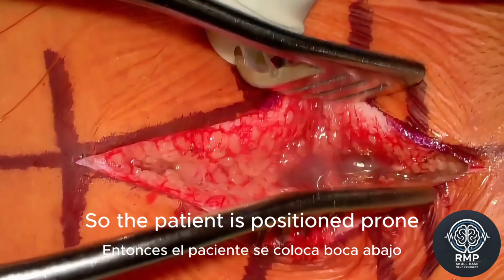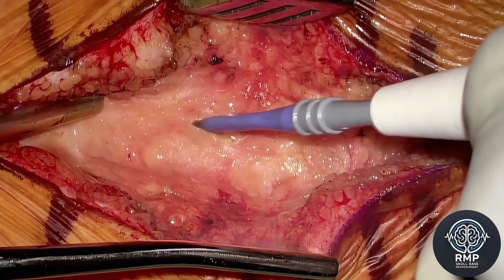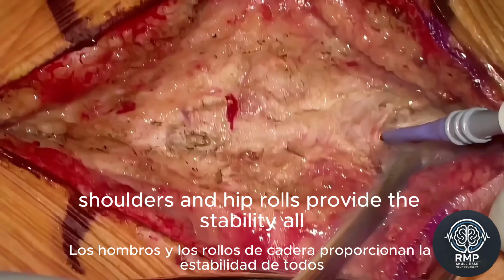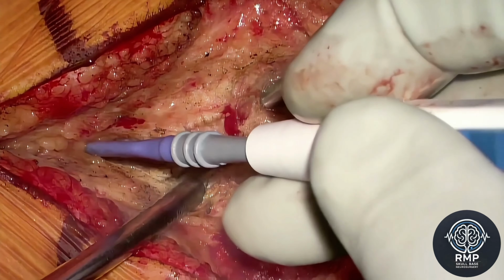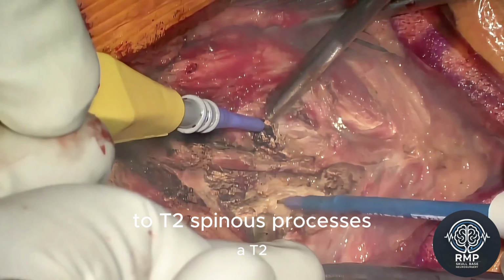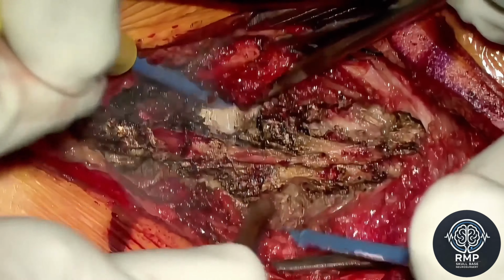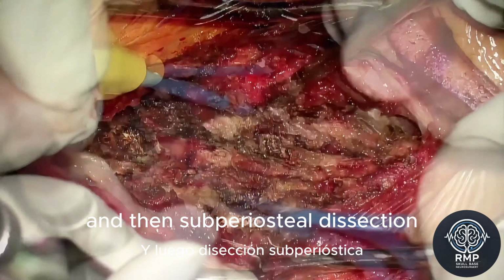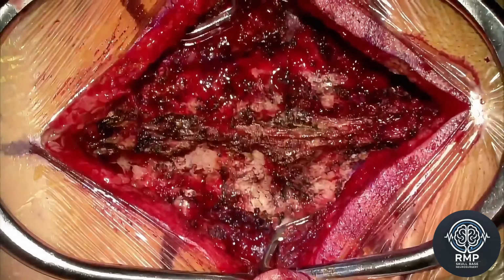So the patient is positioned prone with the head in a neutral position using a Mayfield head clamp. Shoulder and hip rolls provide stability, or alternatively, a Jackson table can be used for support. The skin is incised over the C6 and T2 spinous processes, followed by fascial opening using the electrocautery, and then subperiosteal dissection exposes the C6 to T2 laminae.